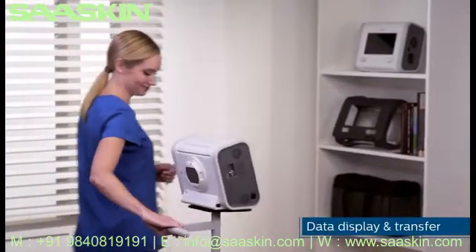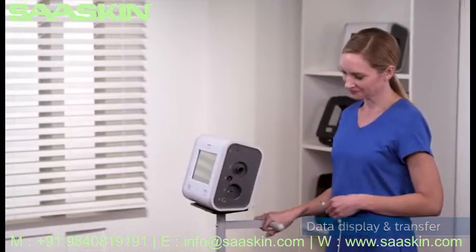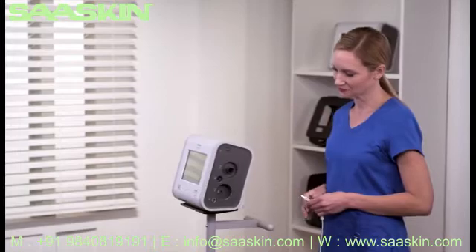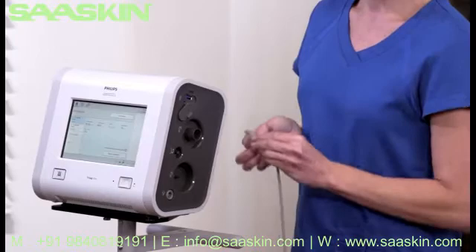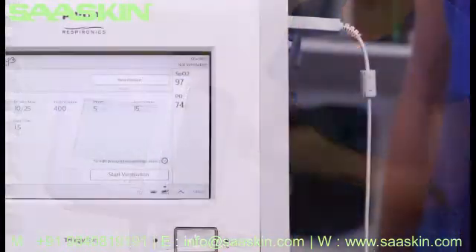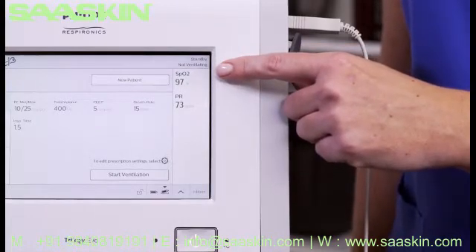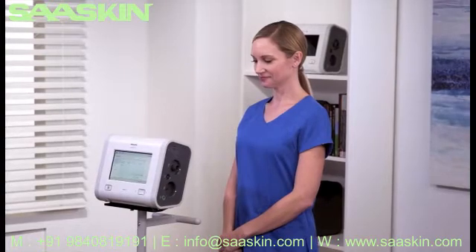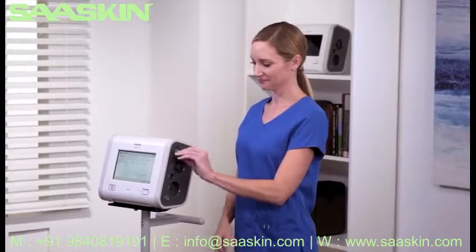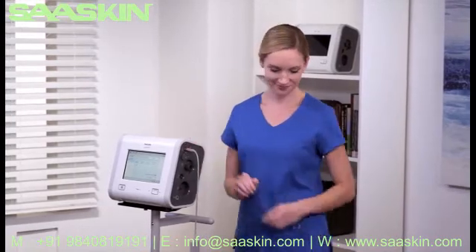Trilogy EVO offers several connection options for displaying and transferring data. We'll review the data display accessories: SpO2 and end-tidal CO2. Insert the appropriate cable into the USB on either the patient or utility panels. You can see the SpO2 measurement in the monitor parameters pane and the pulse rate information in standby and various monitoring views. To check end-tidal CO2 levels, insert the USB end of the cable into Trilogy EVO and attach the appropriate airway adapter on the other end.